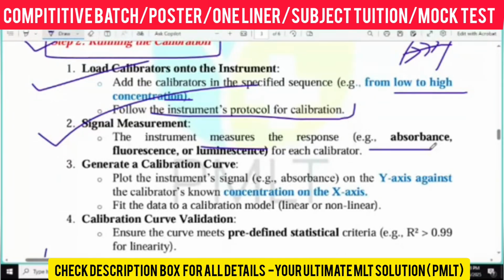If we are doing any kind of immunoassay, then we have to measure the immunosignal for each calibrator. Firstly, you run the calibrator. Secondly, you measure the signal, how they are giving the signal. Otherwise, the graph will not form. Okay, they are collecting the data of the particular calibrator.